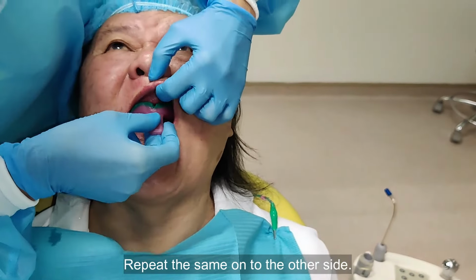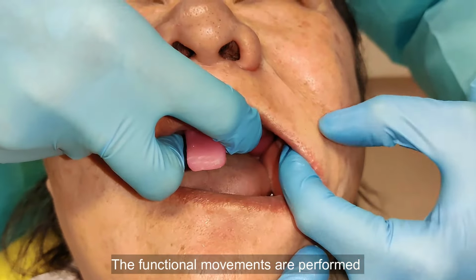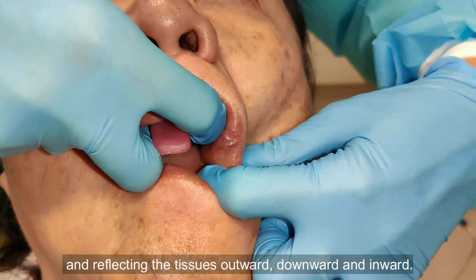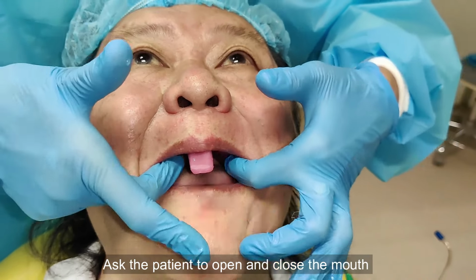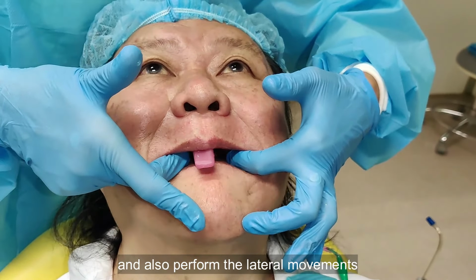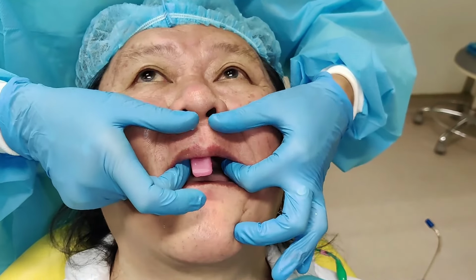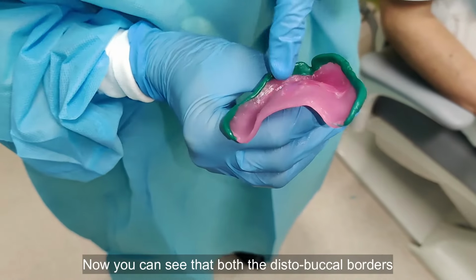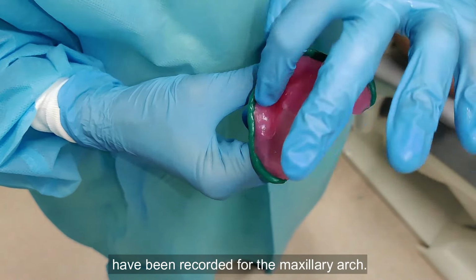Repeat the same onto the other side. The functional movements are performed by holding at the modiolus and reflecting the tissues outward, downward and inward. Ask the patient to open and close the mouth and also perform the lateral movements, that is the right and left. Now you can see that both the distobuccal borders have been recorded for the maxillary arch.